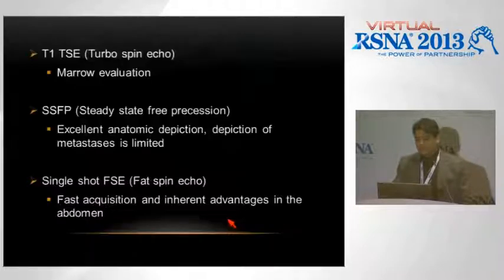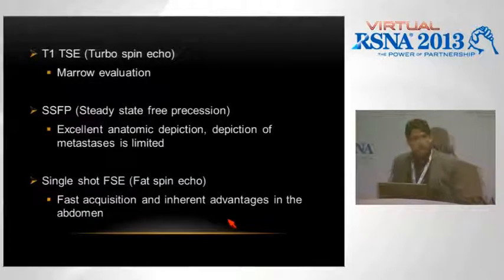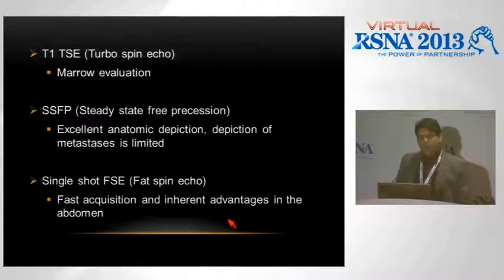What other sequences do we use other than the STIR? T1 clearly excellent for marrow, so we've been using the T1 turbo spin echo.